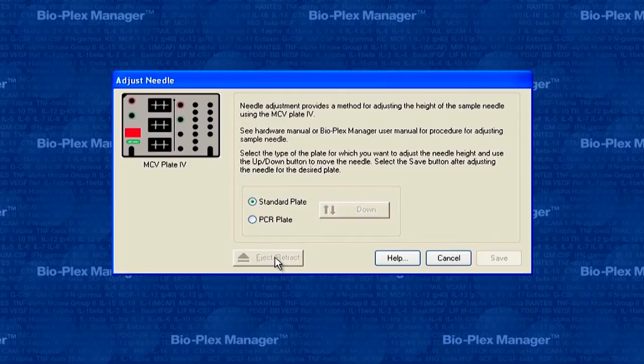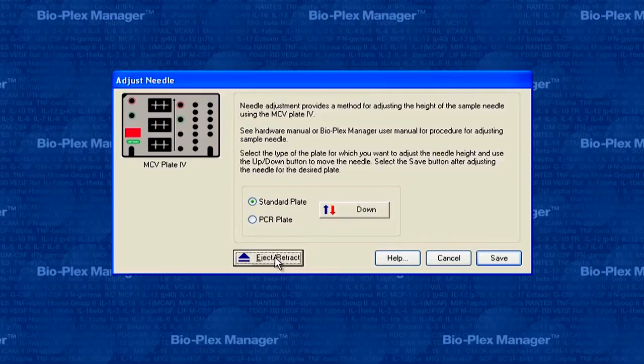Once the needle height is set correctly, click the Eject Retract button to remove the MCV plate and close the Adjust Needle dialog box.